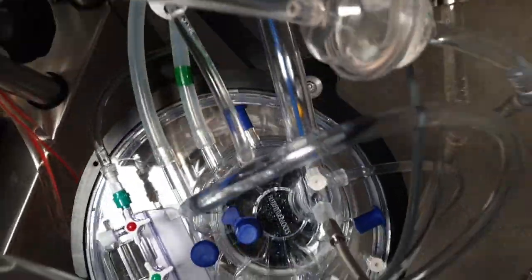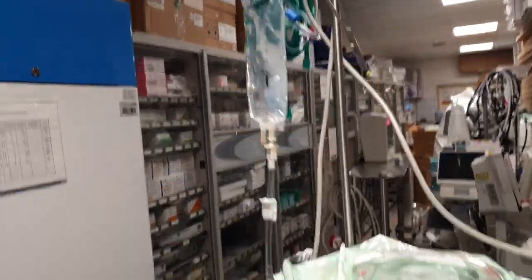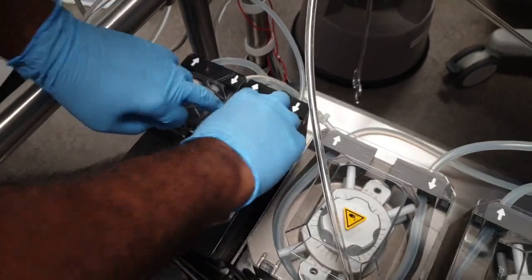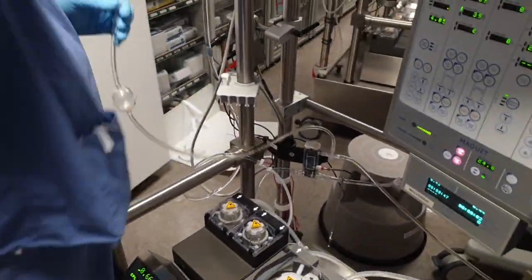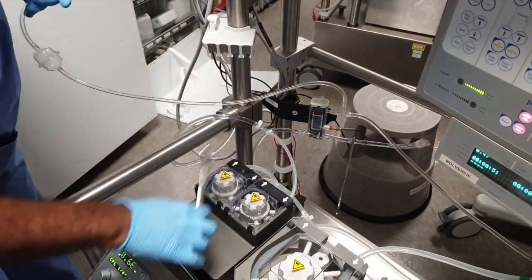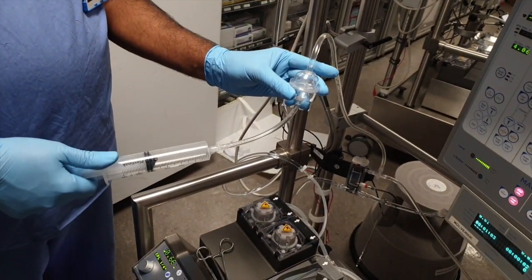What you see is the adult bypass circuit, which can flow up to seven to eight liters of the patient's blood flow. This is the pre-preparation before we push the heart-lung machine into the operating theater.